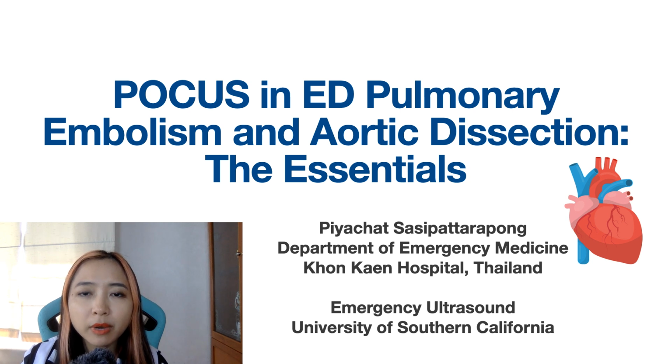Today, I will be talking about POCUS in pulmonary embolism and aortic dissection, the essentials. So let's get started.